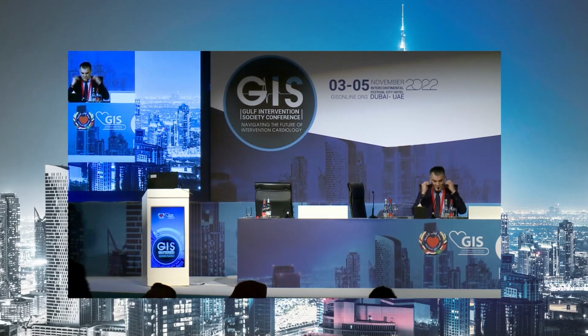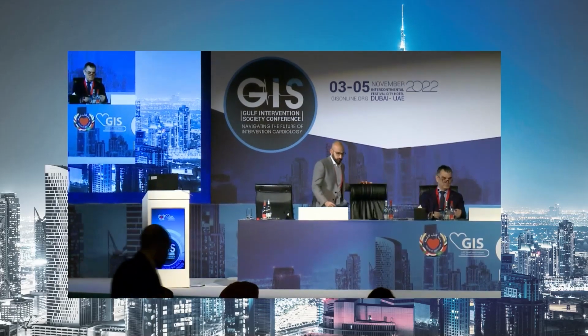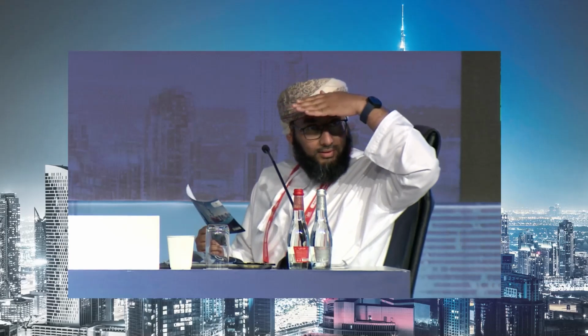So this session is all about OCT. Before we start, whoever is left, how many of you use OCT in your cath lab? Okay, so not everybody. Okay, this is a recorded case, and then Dr. Ueki is going to join us live after the recorded case.